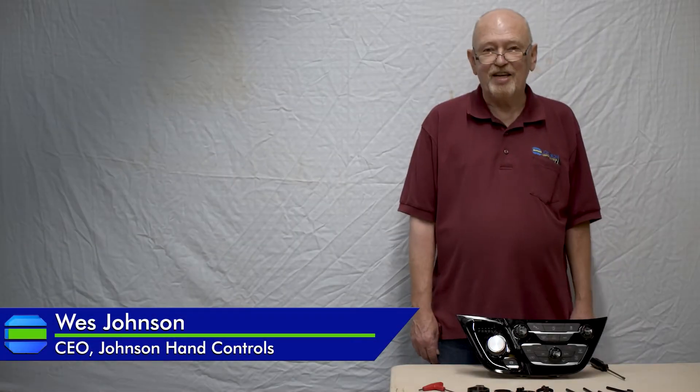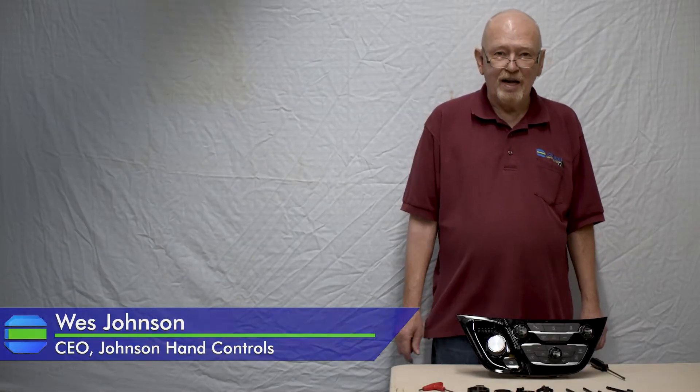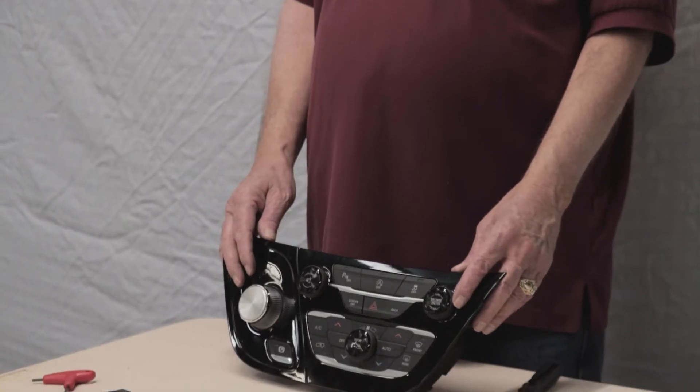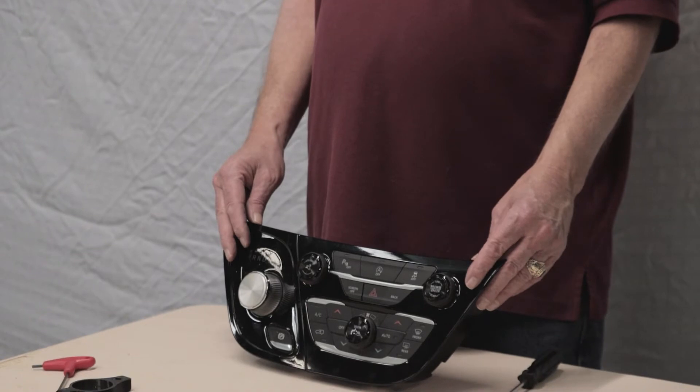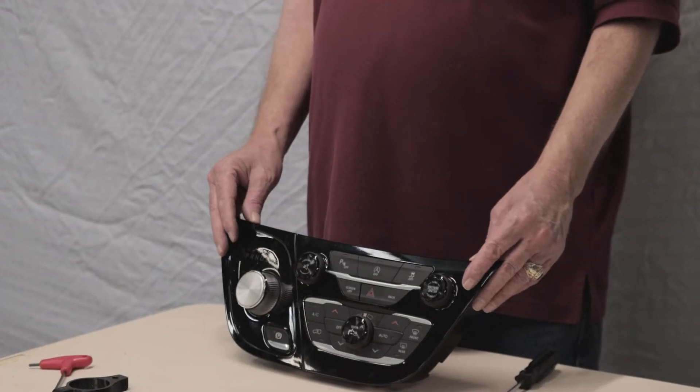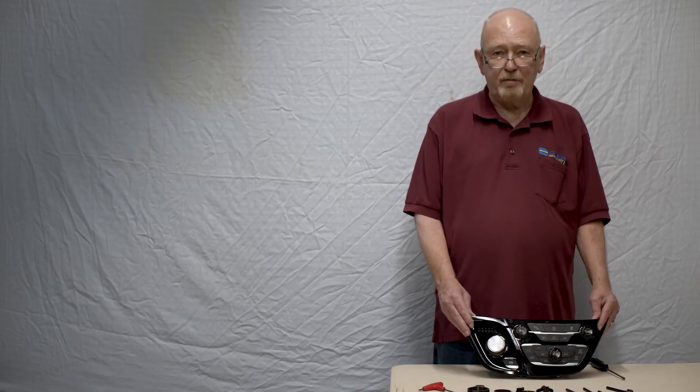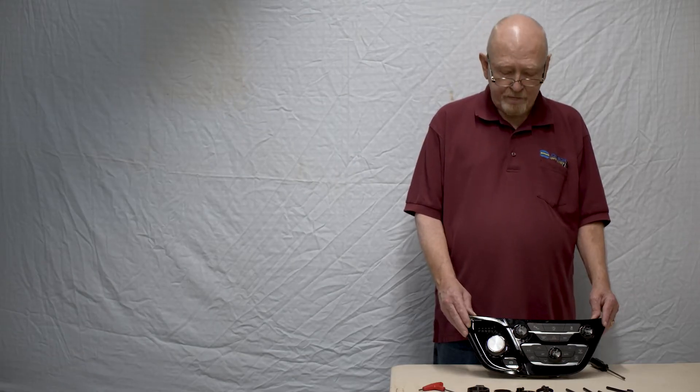I'm Wes Johnson, Johnson Hand Controls. I'm going to show you how to put the mounts on for a Chrysler Pacifica to do extensions for your disabled drivers.